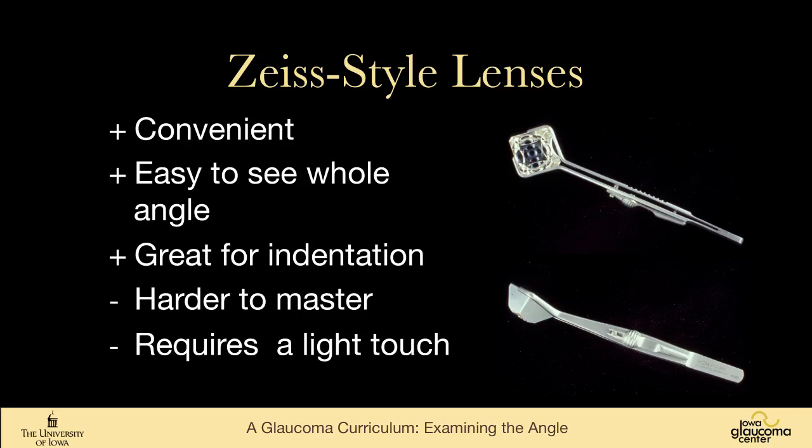The Zeiss-Style lenses, unfortunately, the Zeiss lens itself is no longer manufactured, but there are lenses that we'll talk about that are the same idea, are very convenient. It's very fast and easy to look at the whole angle. They are great for indentation gonioscopy. I think they're a little bit harder to master because they require a very light touch.